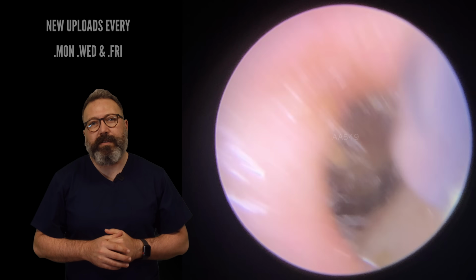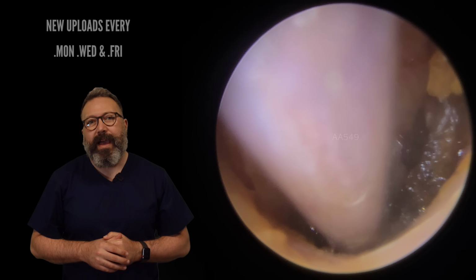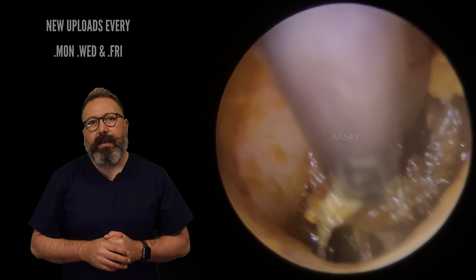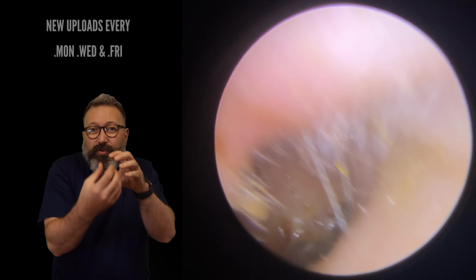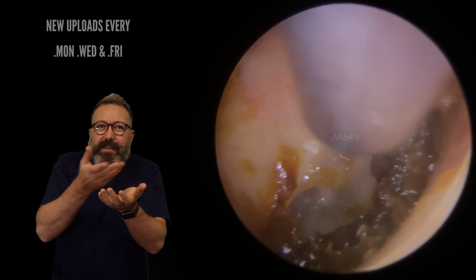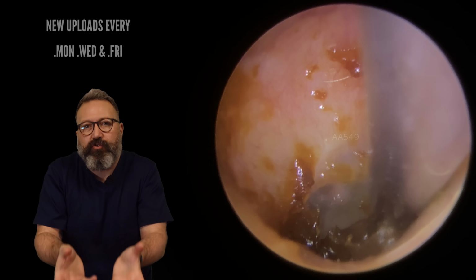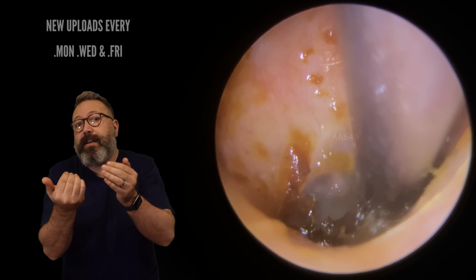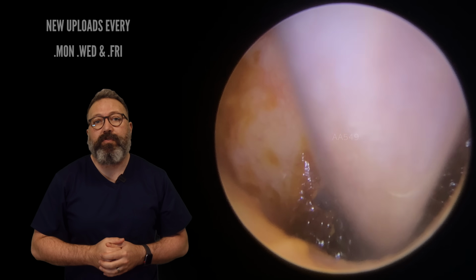Oh, not quite, not quite. There's a heck of a lot down in there, mind. There we go, another little bit of skin. You can see how it's attached, all these little layers of skin that have all wedged themselves down in this recess, and now they're all attached together. So as I'm drawing one up, it just luckily lifts the next section slightly so I can get a good grip here.